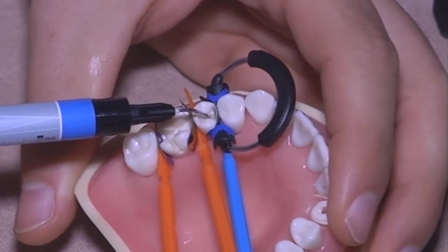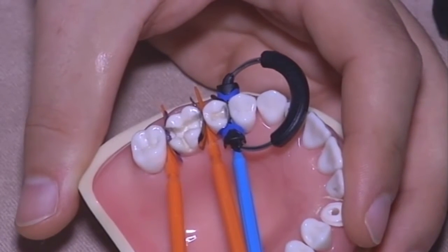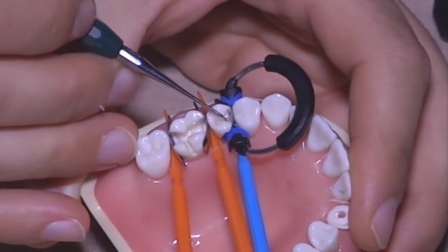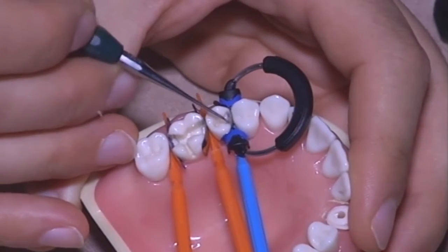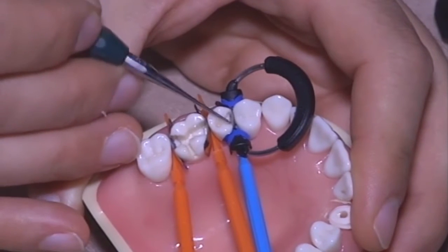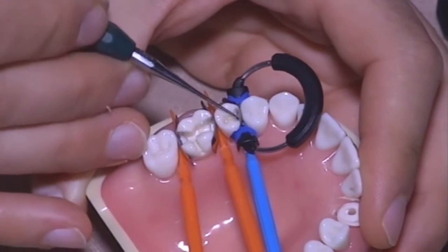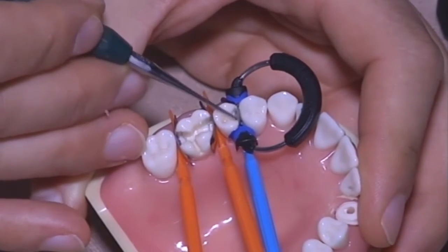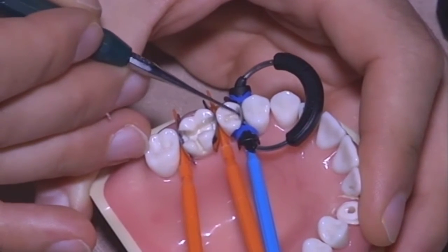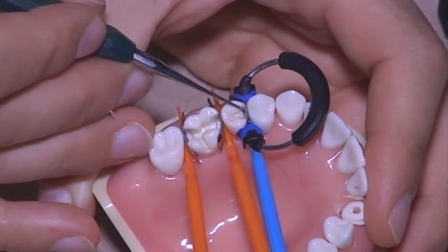I usually place a little drop here, and then with a little pointer you just bring it even inside the proximal area in order to distribute it along all the cavity walls. I always use flowable composite as a first horizontal layer in cavities.